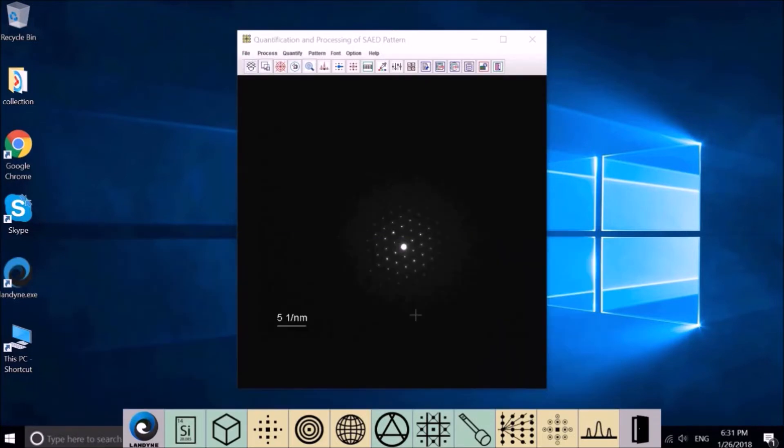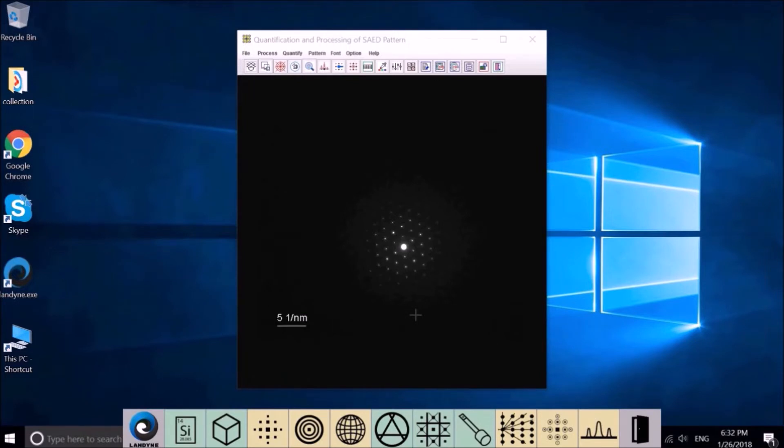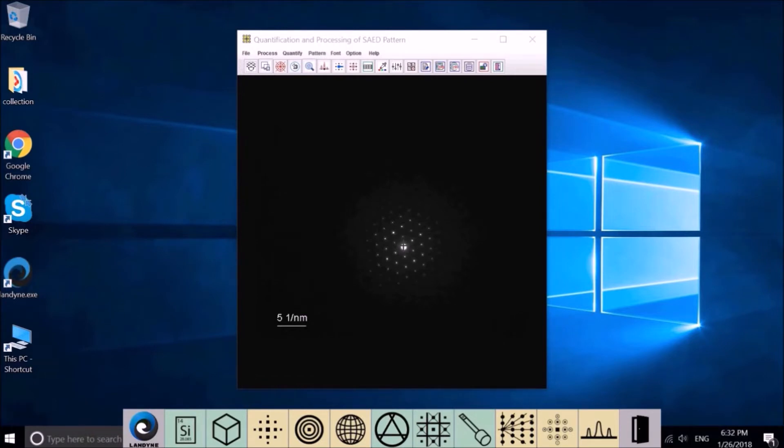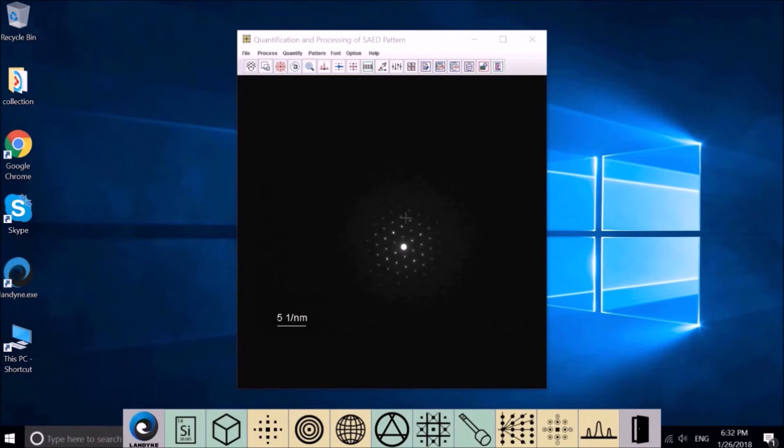The first application is to process the experimental electron diffraction pattern. The experimental SAED pattern is rarely used directly from experiments. Usually the pattern will be cut to square with the incident beam in the center, and also sometimes it needs to be enlarged and rotated to make the pattern look nice.